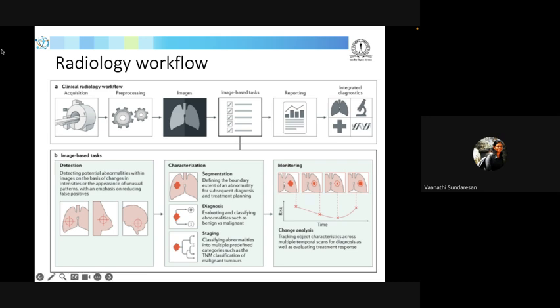The second step is what we call pre-processing. So even if we have a very good quality image, we are supposed to pre-process. This can include very specific steps involved in the particular modality, which is very relevant to our research. To prepare the image, which is conducive for the research, we have to do this kind of pre-processing to make the images of a good quality. Sometimes we might have to reduce noise, sometimes we have to enhance the contrast, sometimes we have to remove the specific parts of the image that is not relevant to our task. So all these things are included in pre-processing.